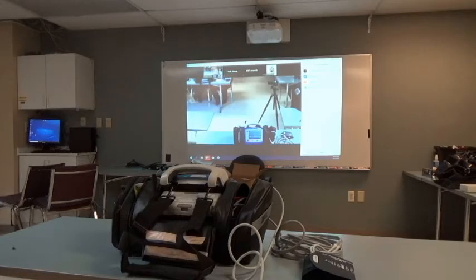But I can never enter capture. Pacer spikes. Now go to your output and slowly bring that up. Okay. So the question I have operationally, we can see this a lot, is say we're pacing somebody on demand and one of the nurses yanks off our electrodes. Is it going to default back into fixed or is it still going to keep trying to be?